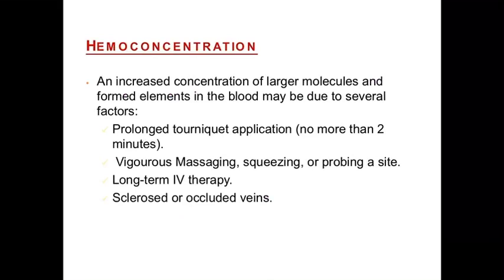Now there is hemoconcentration, an increased concentration of larger molecules and formed elements in the blood, which may be due to several factors. Prolonged tourniquet application: the tourniquet should not be applied for more than 2 minutes. Vigorous massage, squeezing and probing can cause hemoconcentration. Long-term IV therapy can also cause hemoconcentration, as can a sclerosed or occluded vein.